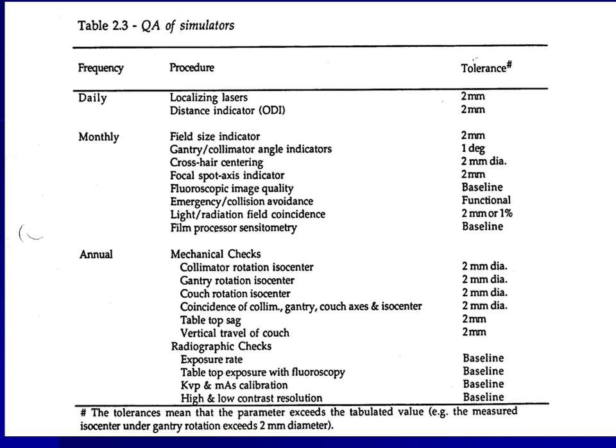What machine is that called? There's one right across. Acuity. Acusim 1 and 2. Okay. We have a conventional simulator. These guys have probably at least seen one, I guess. We do use it for the spine SRS simulations. So we still have one machine we have to do QA on.